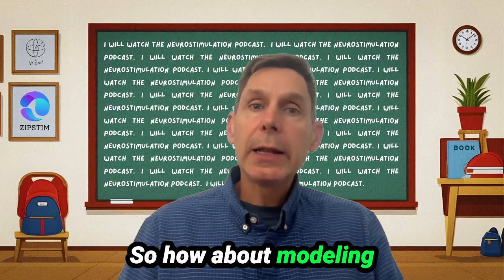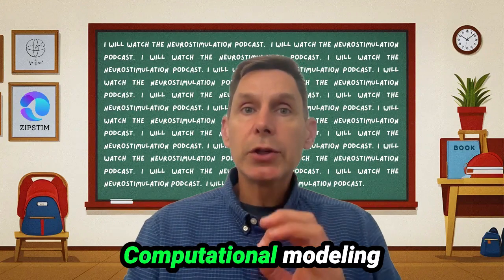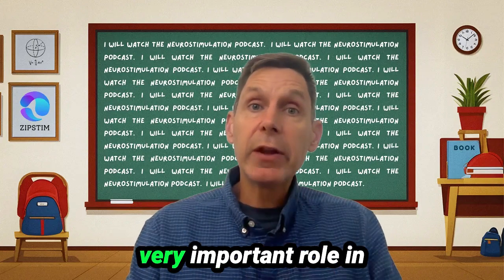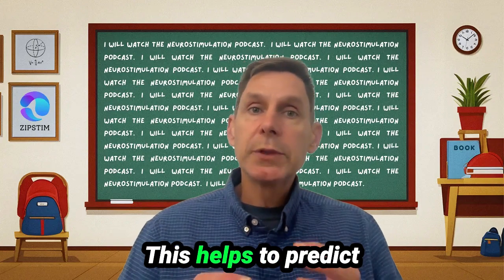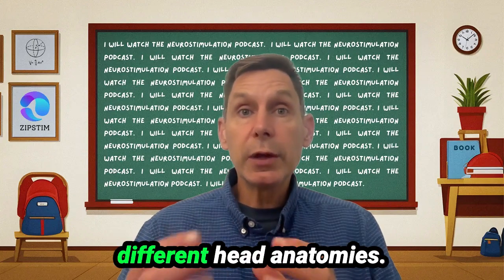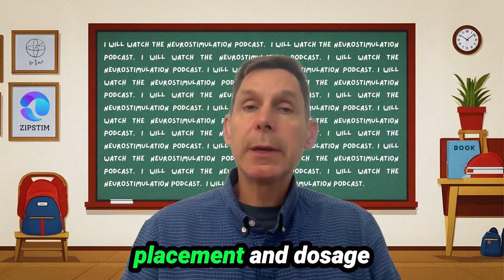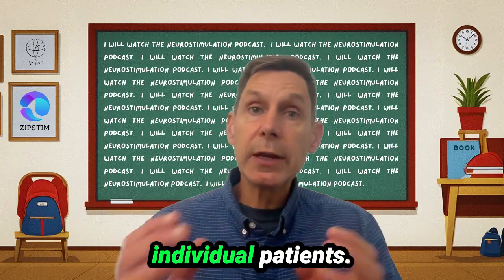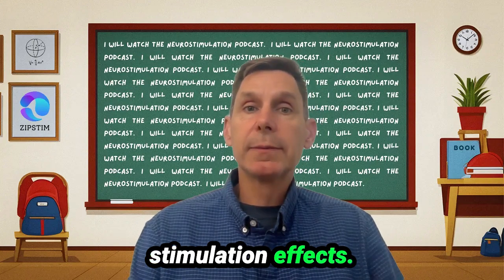So how about modeling and the quest for personalized treatment? Computational modeling appears to play a very important role in modern tDCS research. This helps to predict current flow through different head anatomies. It is guiding electrode placement and dosage parameters for individual patients, and it's informing our understanding of multi-region stimulation effects.